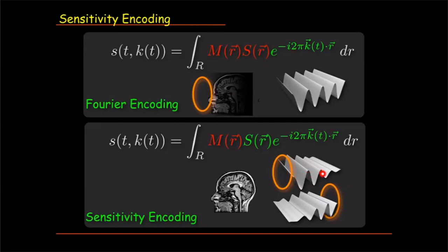going to look like a complex harmonic that is weighted by the sensitivity this way, and this complex harmonic weighted by sensitivity this way. But I measure those 2 inner products at the same time because this is the data I'm getting from the receiver. The data I'm getting from the receiver is in parallel. And that's why it's called parallel imaging, okay? Because I receive the data in parallel.